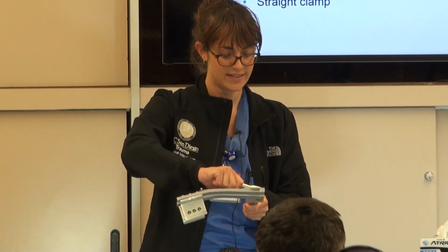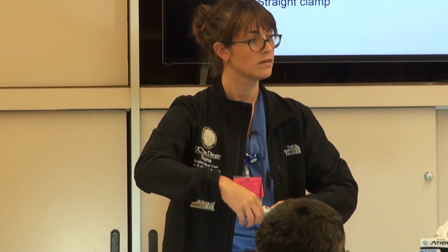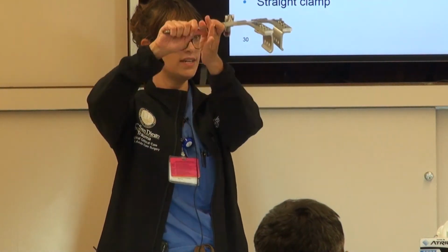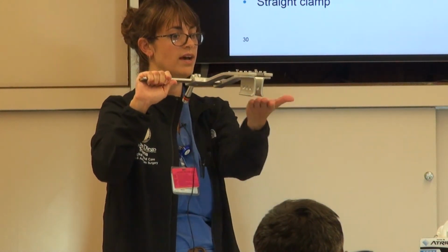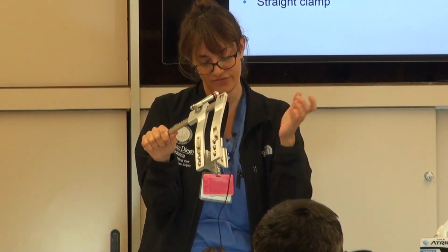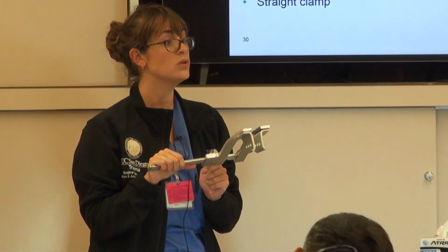So how did I get it wrong? I put one on and then Kobayashi said it's backward. So backward will be this. See again, they curve out. Curving out, okay? If they curve in, they don't hold on to anything. So they have to curve out. So they'll be like, oh God, it's backwards, and they'll take out their hand and they'll be fumbling. That's why.